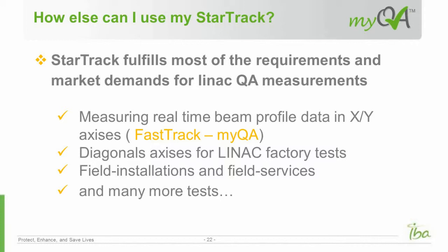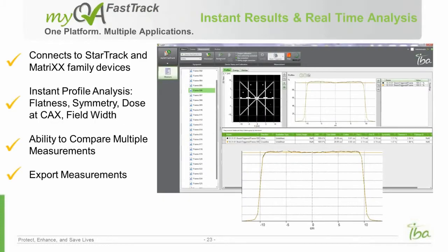For field installations and field services, if you're a commissioning group and you need to throw a device quickly on the table and do quick measurements, it's perfect, it's easy, it's compact, you can put it in the back of a car, it has a nice little case, and there's a lot more tests which you can do.